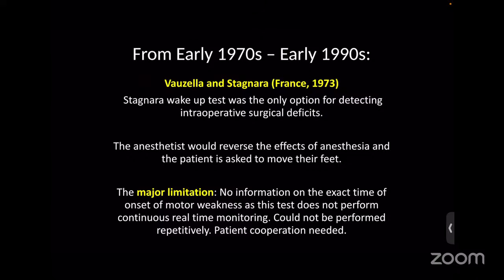The anesthetist would reverse the effects of anesthesia, and the patient was asked to move their feet. Now, there were major limitations to this. You needed the patient to cooperate. First, counseling them that this was going to happen was a big deal. Second, it was not continuous monitoring, nor was it real time, right? So it was only when the surgeon asked for the test. And lastly, it could not be performed repetitively.